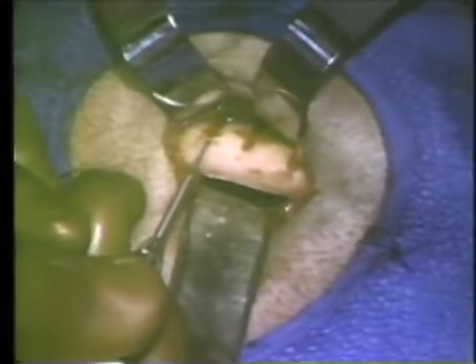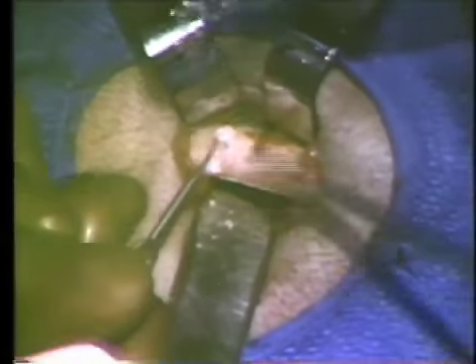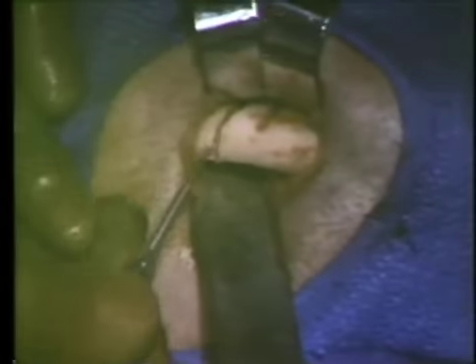In this procedure, a great deal of care is taken to preserve the inferior alveolar neurovascular bundle. And you will see in a moment, as the cortical block is removed from between these two cuts, you'll see the little bony canal that surrounds the nerve and blood vessels, and effort is made to preserve that tract.